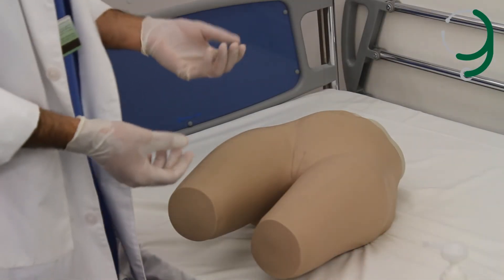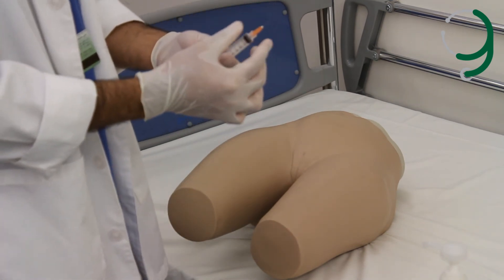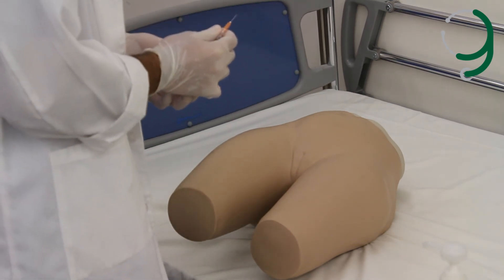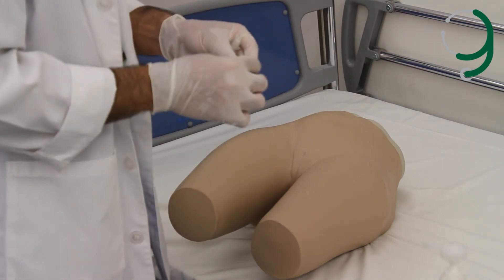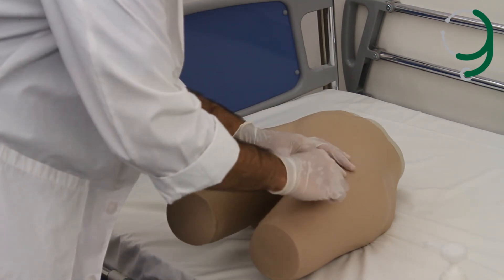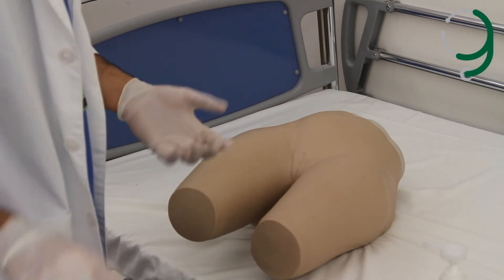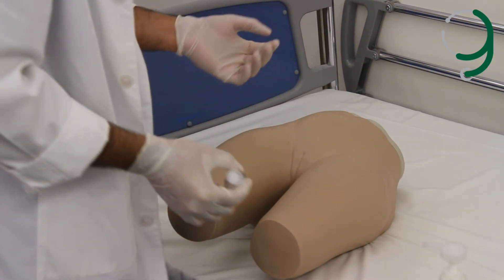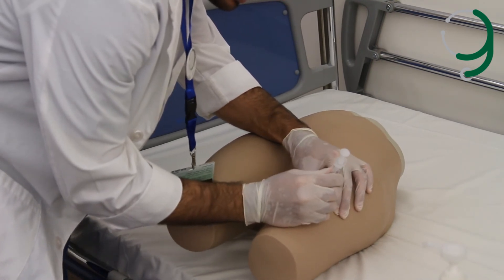For the subcutaneous injection, we use the 25-gauge needle. We attach it and do the same preparation — making sure the area is clean and wiping it with the alcohol swab three times. Here we don't need to use the Z-track technique; we just pinch the skin to make a fold, then go in at a 90-degree angle and inject quickly.